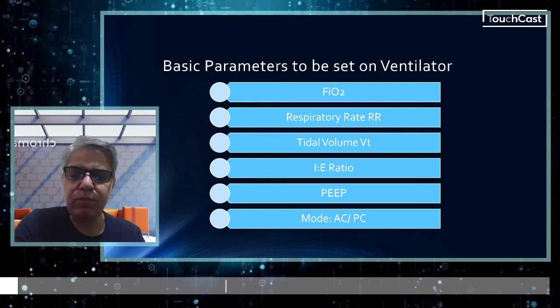So it is a very important concept that we should understand what PEEP is, and how to adjust PEEP, and understand its role in keeping the alveoli open, recruiting the alveoli, and actually improving oxygenation. And then the mode. There are different modes.